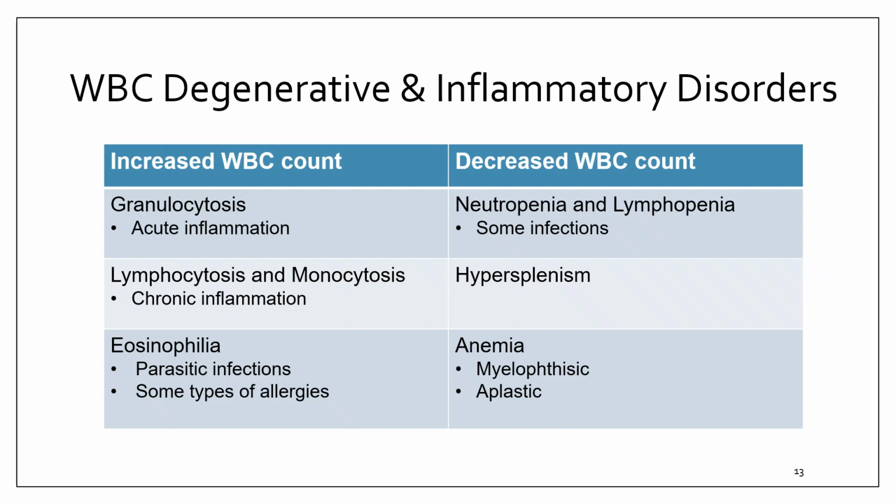Then there's eosinophilia. Eosinophils increase in parasitic infections, in some allergic conditions, as well as asthma and drug reactions. So the smear appearance, eosinophils are easy to spot. They have a bilobed nucleus and bright red-orange granules. So they're basically screaming, I am not subtle. Those granules contain major basic protein. It's designed to damage parasite membranes. Great for worms, not great for surrounding tissue.